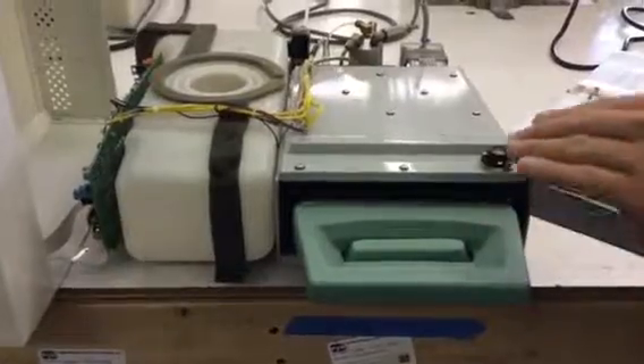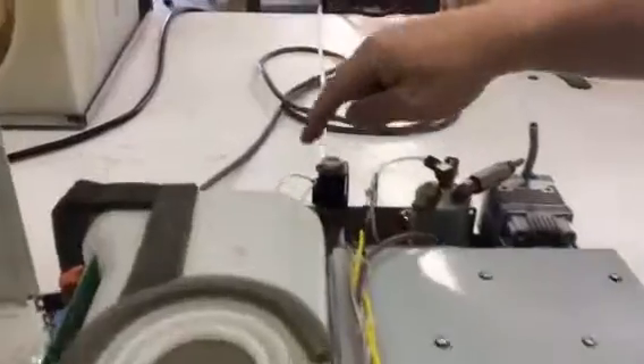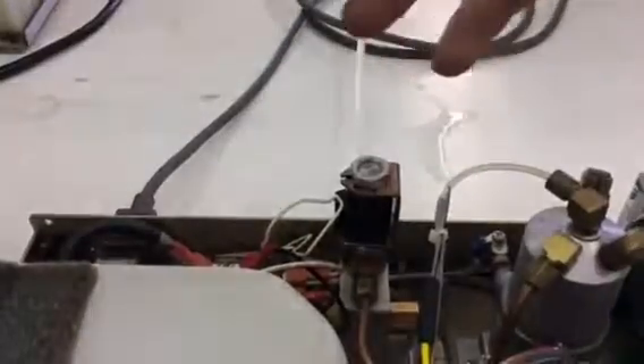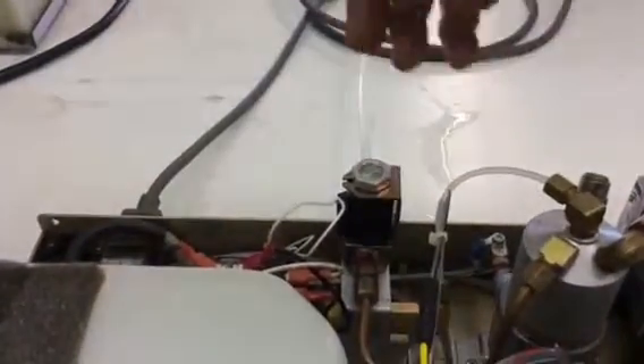If no visible steam leaks are coming from the seal, we're going to look at this solenoid. This solenoid is built of a coil, a plunger, and a stem. Usually what happens is a piece of string or a needle tip or something like that will get stuck inside of this solenoid coil, preventing it from venting and exhausting as it should.